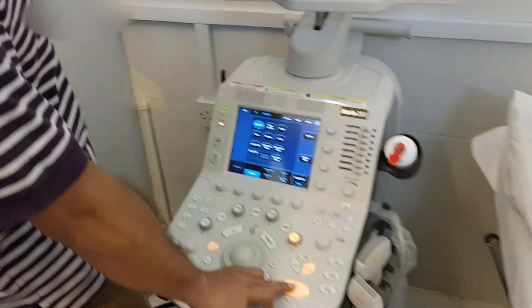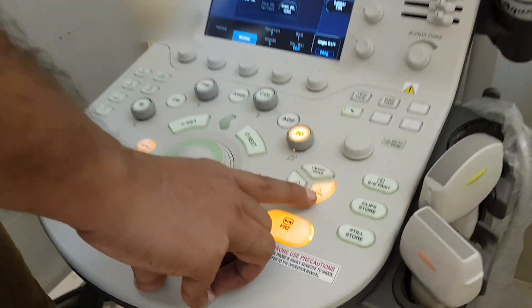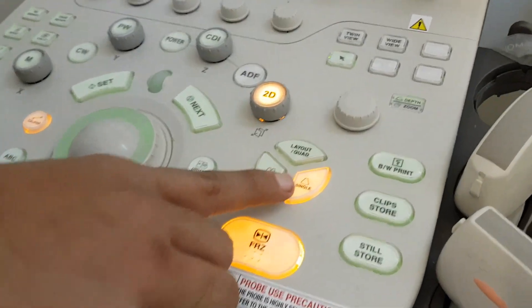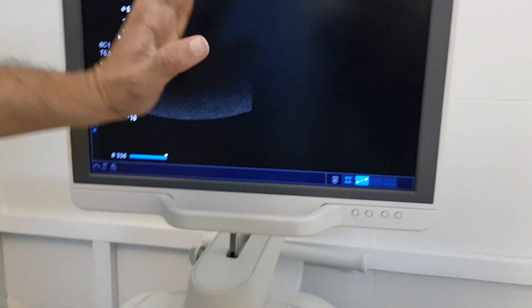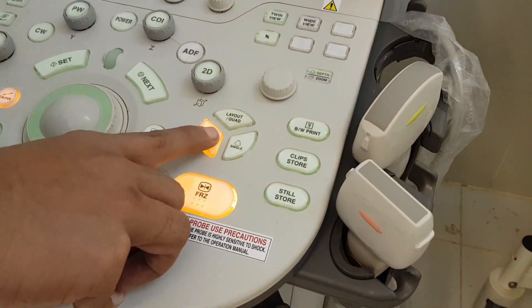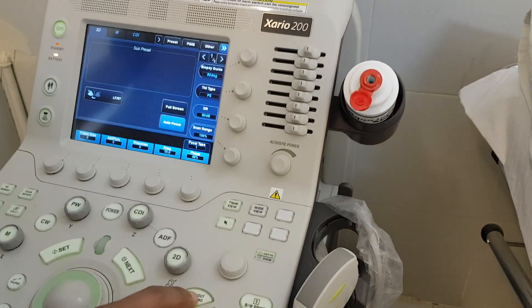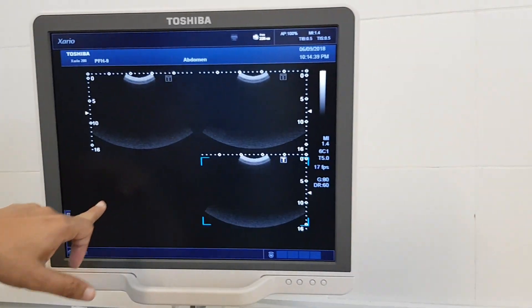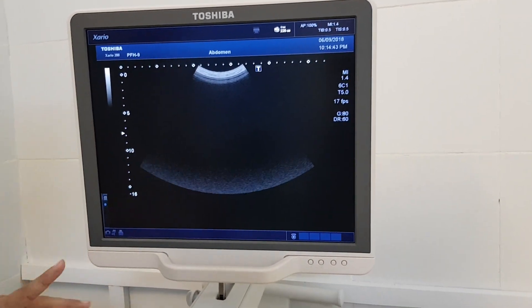This button on the freeze button gives you a window setting: Dual and Single. On the screen you are looking at one image. If you press the dual button, the image will be divided 50-50. When you press it again, the other window comes. There is also quad — if you press it, the screen becomes four images. It all depends on how many images you want in one study: two or four.